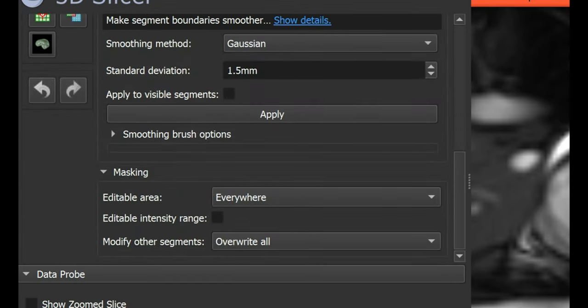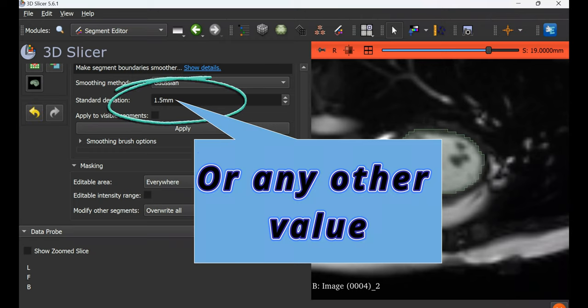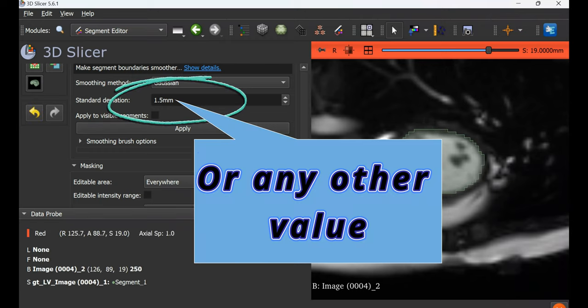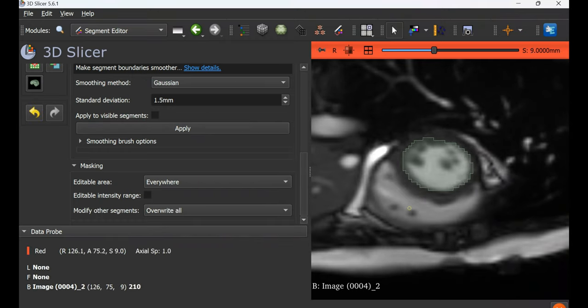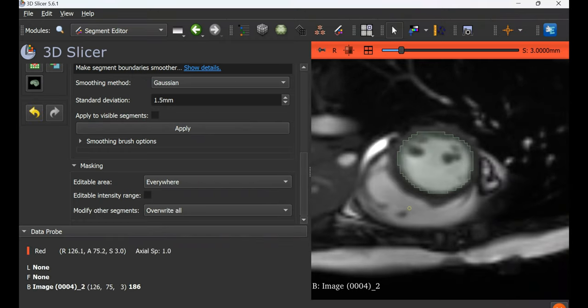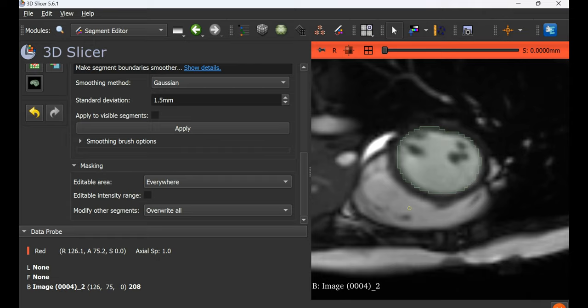Keep the standard deviation at 1.5 mm and then click apply. Now you can see that not only the current slice but all slices have been smoothed.